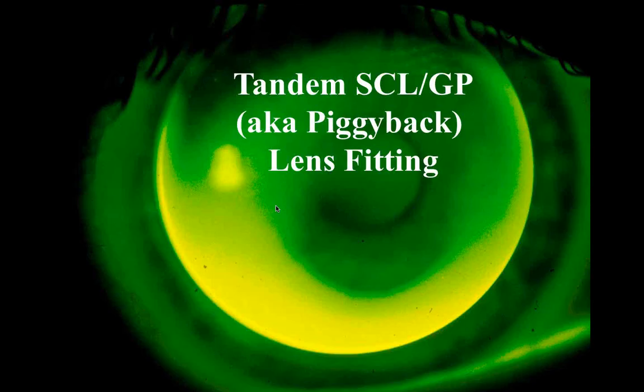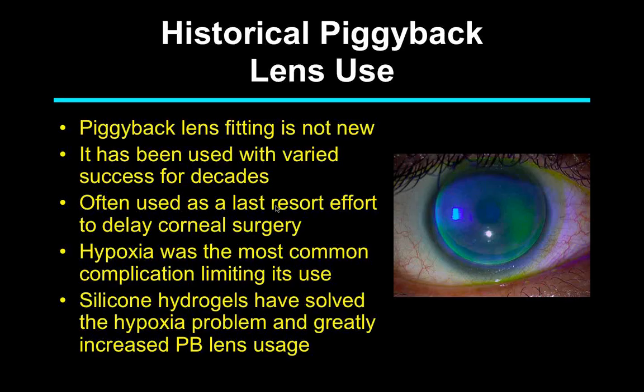Tandem lenses. Tandem, soft and rigid, or piggyback. There are two ways of doing a piggyback lens. Historically, piggyback is not new, been around a long time. Back in the early days, we used piggyback lenses as a stopgap measure before taking a patient to surgery. And the reason was that we didn't have good plastic. The gas perms were relatively low Dk. The soft lenses we had were HEMA only, low Dk as well.